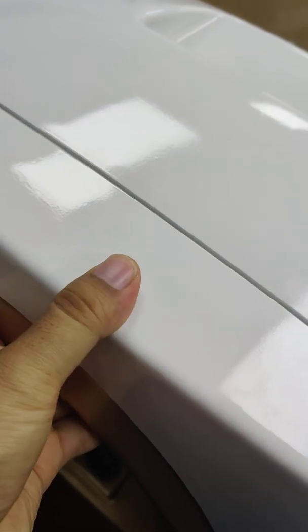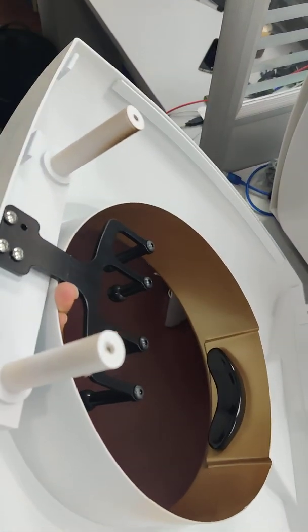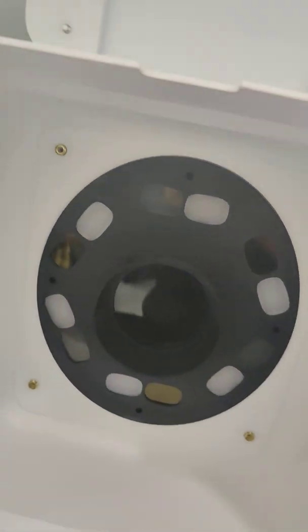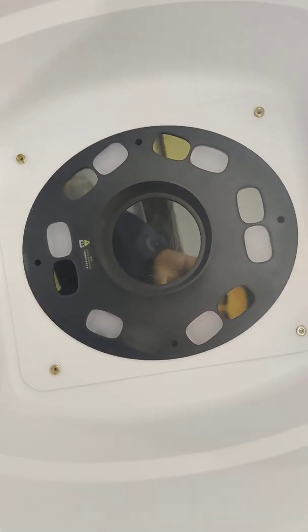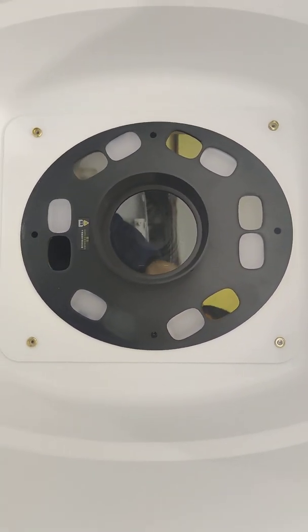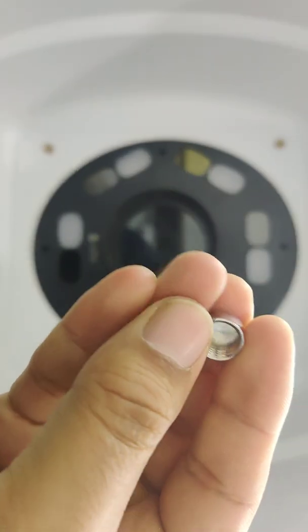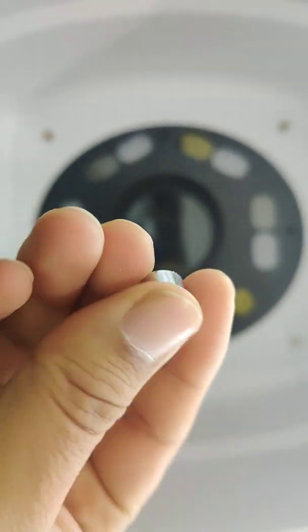Then you can take off this front board. Now we can see, I take off this front board. Okay. Now look inside. There are 4 screws. Okay. 4 screws we need to take off. But first we need to take off this cap.